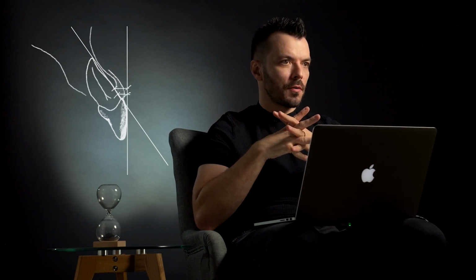The second thing to consider is the relationship to the tissue, or even more specifically, the relationship of the future prosthetic piece with the tissue, aka the emergence profile. There are two very important things to consider, especially in this case where you crown lengthen. One, maxilla is centripetal. As you go up, it goes in. Means the more you crown lengthen, the more aggressive your teeth profiles will become. Second, you have to imagine that your prep is on a structure that's under the tissue, anywhere from 1 to 3 millimeters depending on biotype, but is always closer to 3 than to 1.